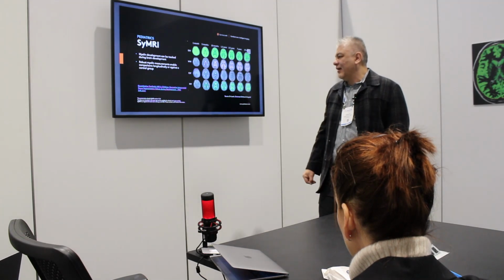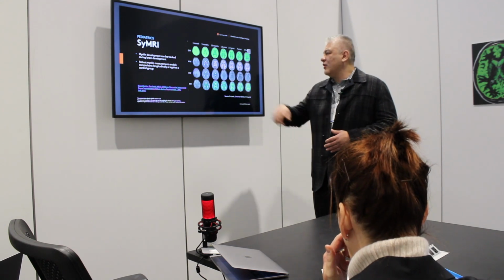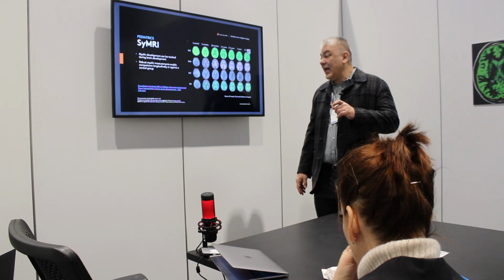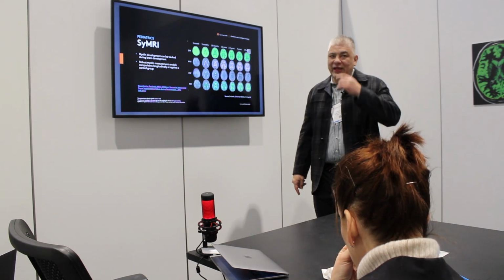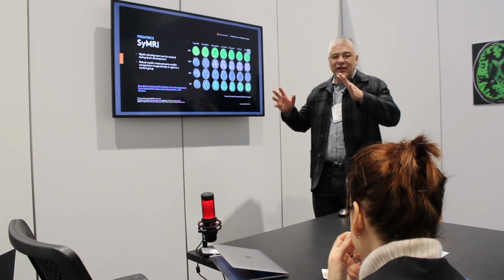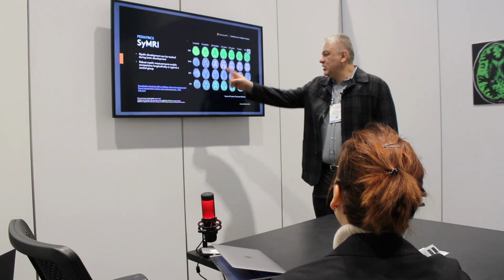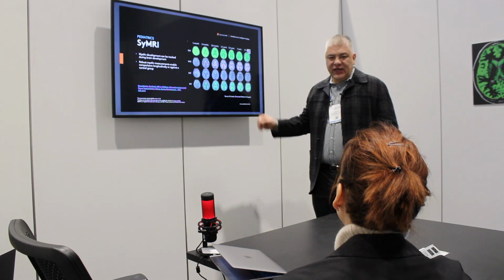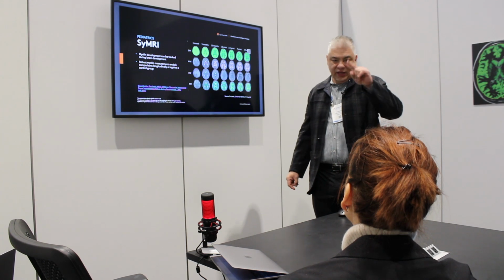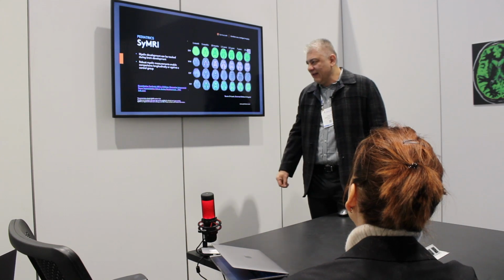Same to follow up on myelination. That can be hard. And I actually have a case where it allows us to see how the myelination progression is, and it's all validated by age. So you can go to some atlas and try to see, well, is there internal capsule, is there corpus callosum, is there, well, it takes a long time. The map will give it to you immediately. You can see immediately what parts are myelinated, and it will tell you the myelin is abnormal in this kid, and then you start looking and, okay, yeah, it's abnormal because this is missing, and it shows you right away. Again, validated by article.